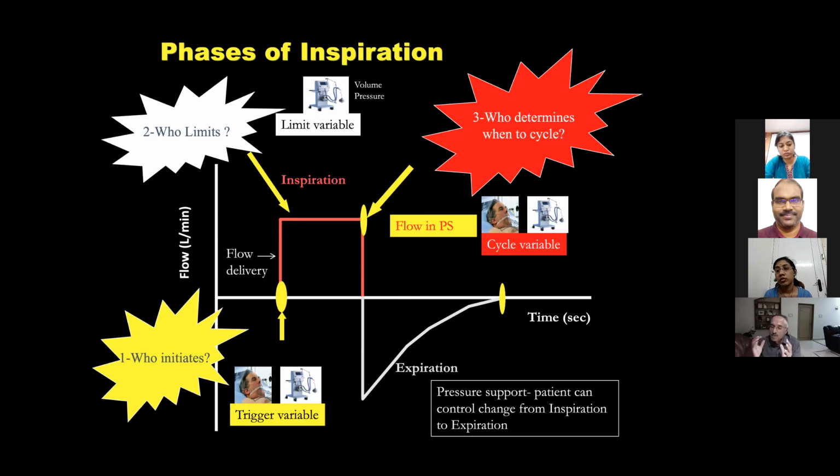In fact, pressure support is the mode where I would say about 80% of the time the patient spends on a ventilator. So you have to understand pressure support properly. That's the only mode which allows the patient to change from inspiration to expiration. Understood? In all the other 4 modes of the 5, the ventilator changes from inspiration to expiration. Which is the only mode where the patient can initiate a breath and change inspiration to expiration? Pressure support. Understood? Okay, I'll teach you what it is. You just remember that.